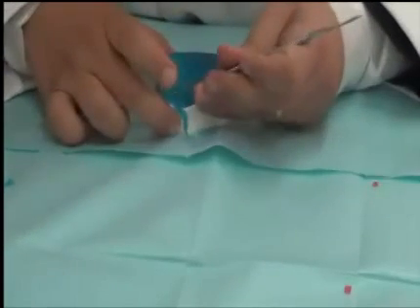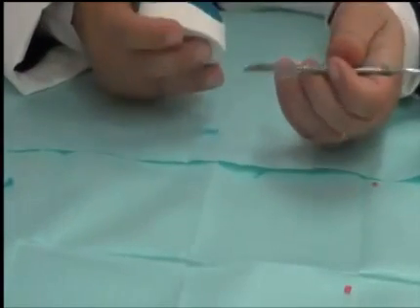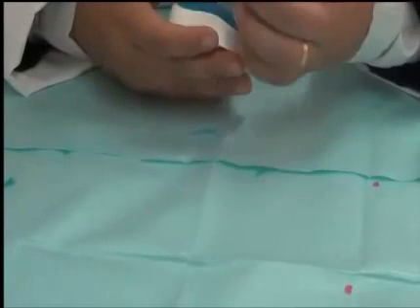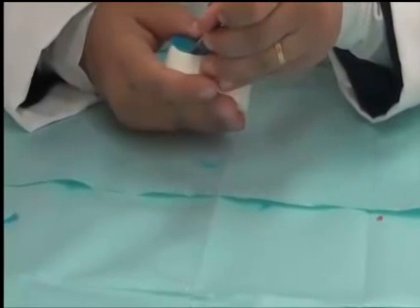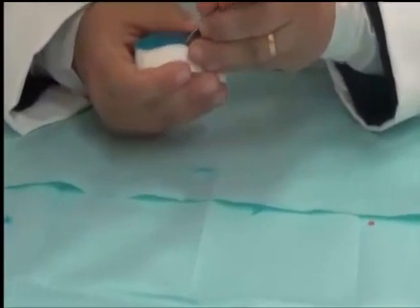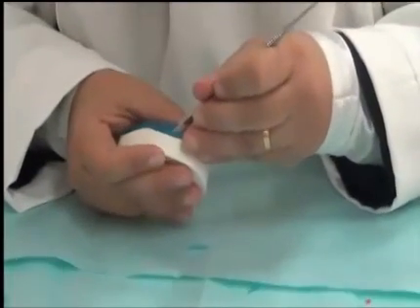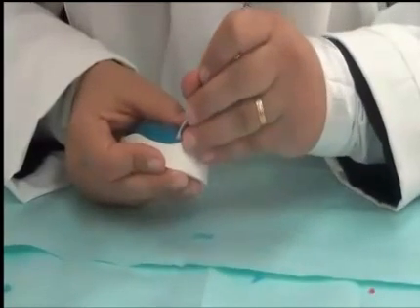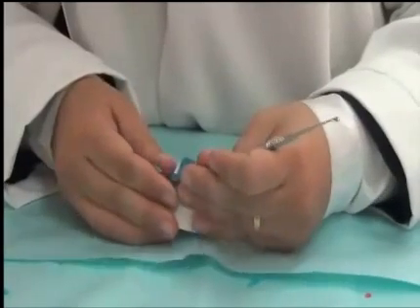Once we have all of the material in location, the material is adapted, and now we can cut to the line that we have drawn, which is 1 to 2 millimeters away from the sulcus. We're following the line. It's drawn 1 to 2 millimeters away from the surface. And we're removing the excess once more.